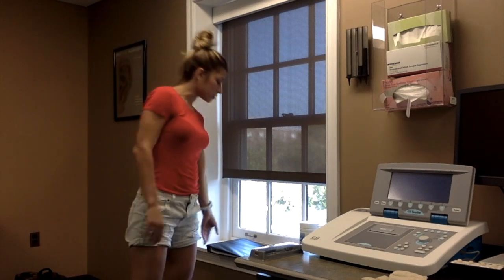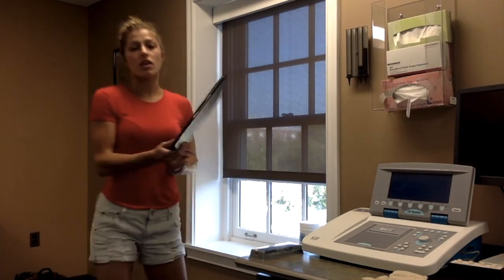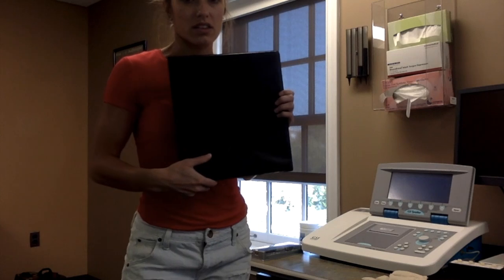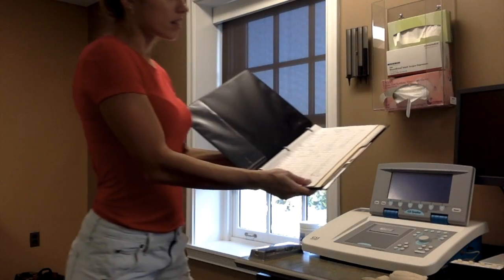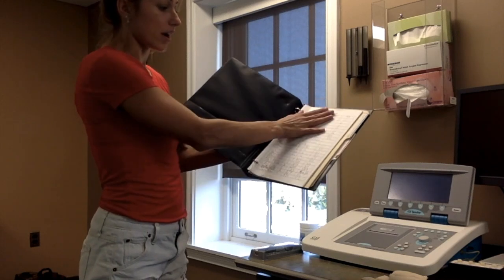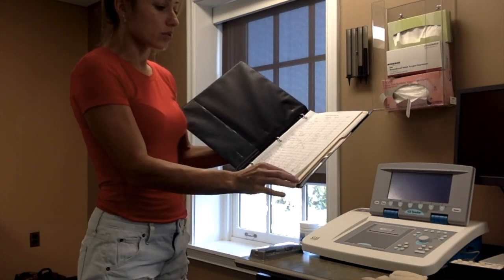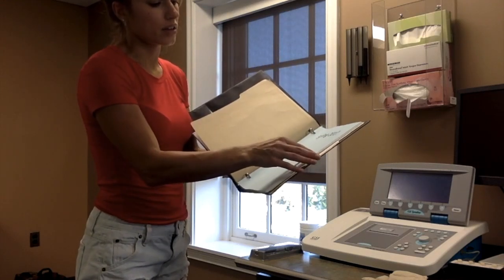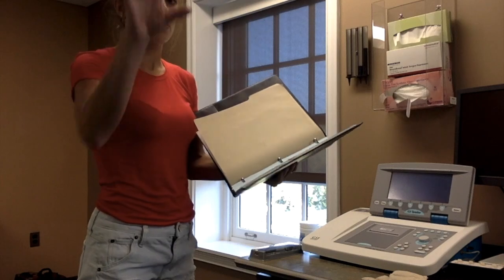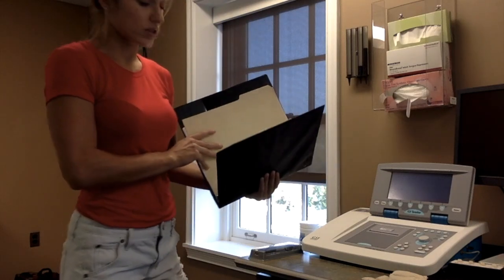As soon as you walk into the audiology booth, you'll come to the windowsill and find the binder, which has the available times to sign out the booth in order to perform your screening. In the very beginning of the binder, you'll find available spots to sign out a portable audiometer. And in the back of the binder, you'll find the available times to sign out the booth itself to perform a hearing screening.